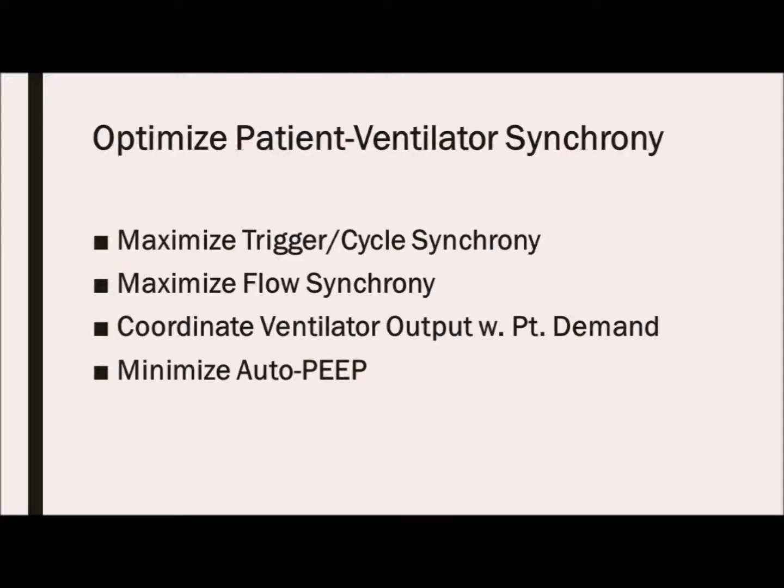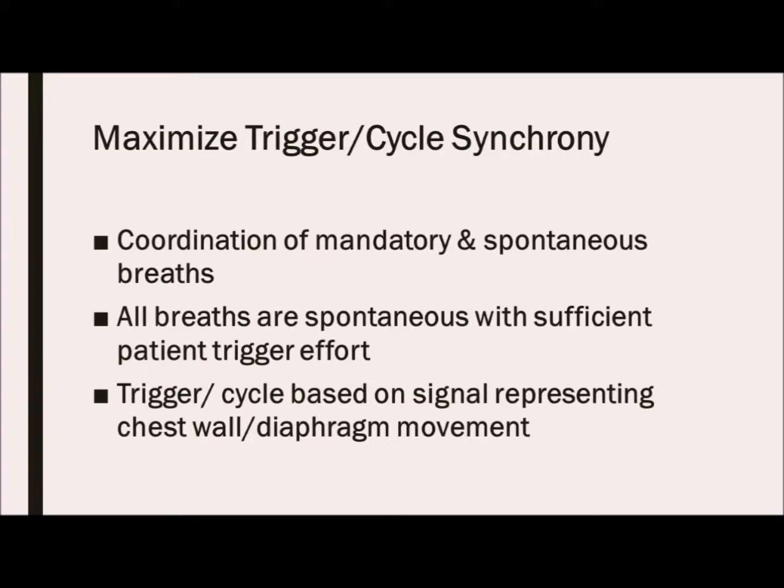With optimizing patient ventilator synchrony, we also have 4 aims. The first is to maximize the trigger and cycle synchrony. Second, maximize flow synchrony. Third, coordinate ventilator output with patient demand. And fourth, minimize auto-PEEP.